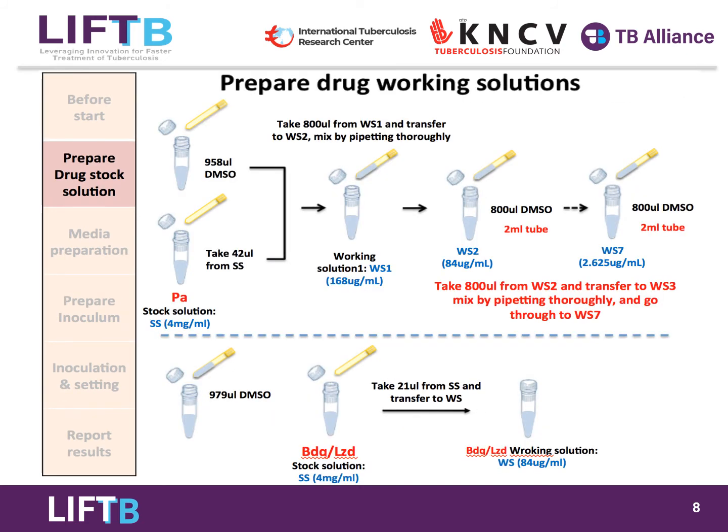Working solutions of each drug should be prepared immediately before each experiment. Remove the stock solution of each drug from the stock boxes, thaw at room temperature, and keep on ice before use. Do not use leftover working solutions again, but discard after each test.